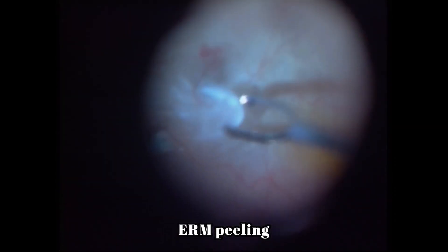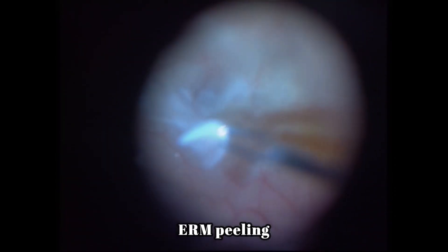You can see in this case that there is an inferior detachment coexisting with the membrane, and so the membrane is removed first. After that, the retina is put back followed with endolaser and fluid-air exchange.